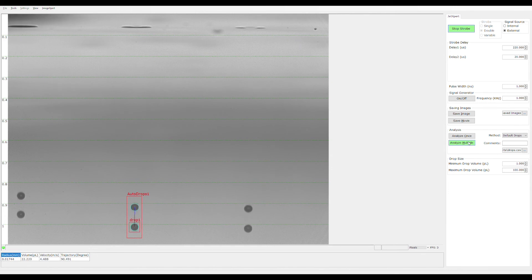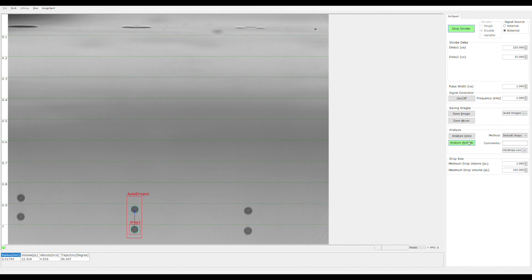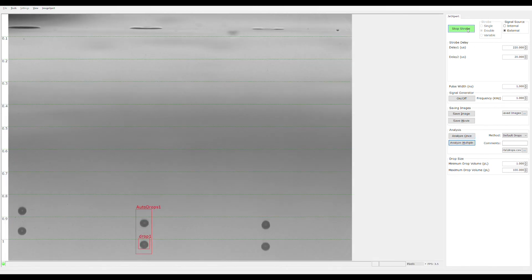Whether you have one dispense tip or multiple, the software is able to analyze all of the drops automatically. We can even save images or movies of the drops that can be analyzed later as you're performing verification for a printer.